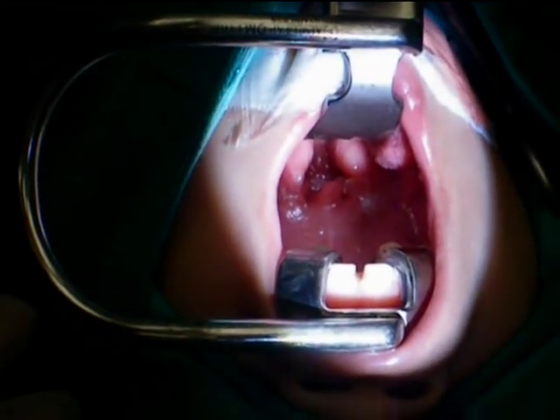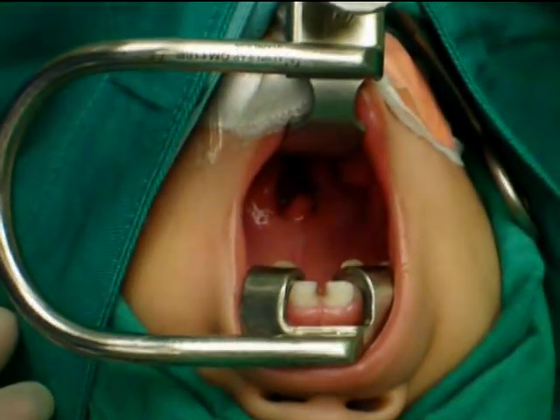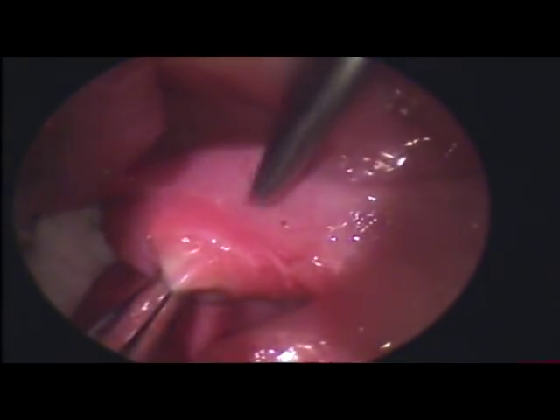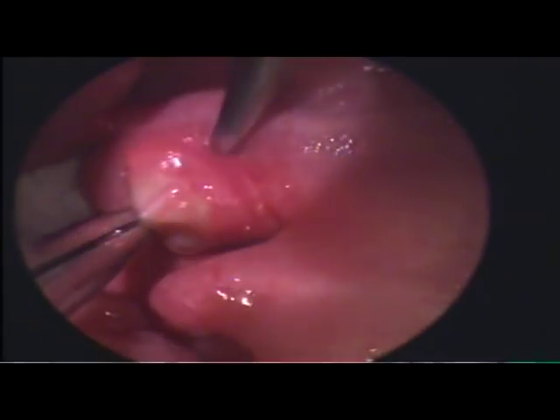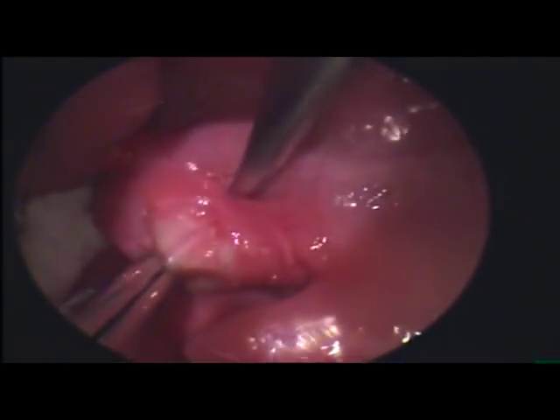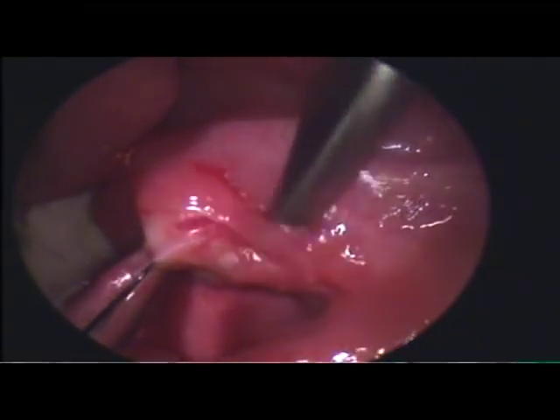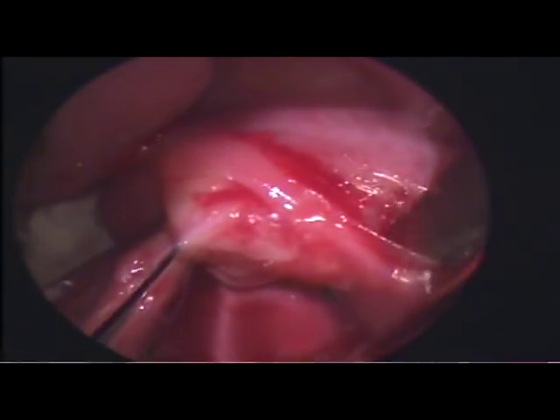Before starting the surgery, ensure adequate lighting is available. This is an endoscopic view of a tonsillectomy. There are many ways to do the surgery.